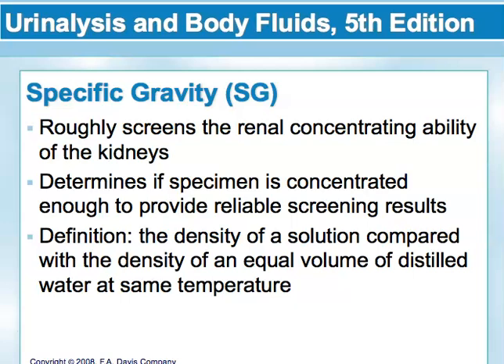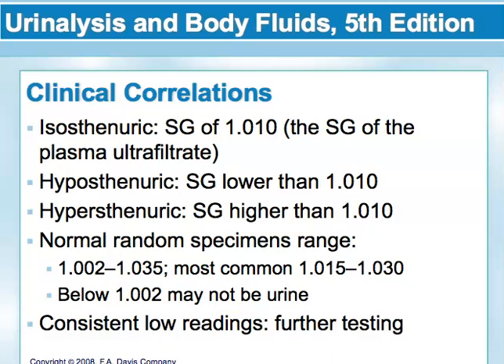Currently, the only method in use that would require correction is the refractometer. Chemical reagent strips and osmolality would not require correction. A little bit of terminology here.